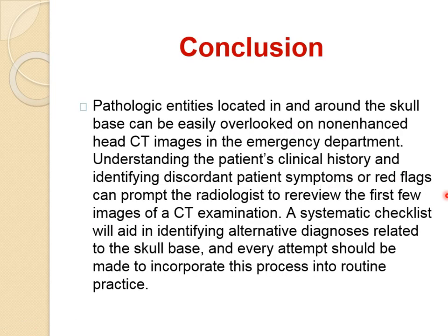In conclusion, we must look carefully around the skull base so as not to miss any lesion in the skull or any fracture. We must also check the extracranial spaces for any extension of infection, fracture, hematoma, or neoplasm. We keep a list in our mind in order not to miss any lesions. Thank you very much. Comprehensive review of the pathologies of the skull, especially in the emergency department.